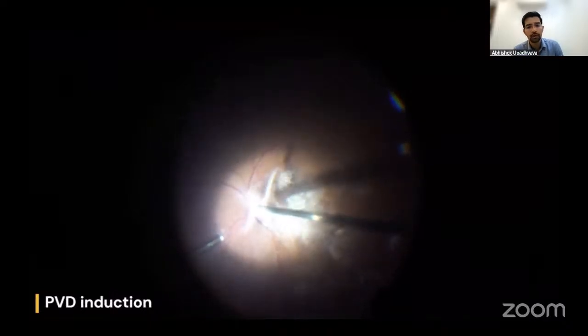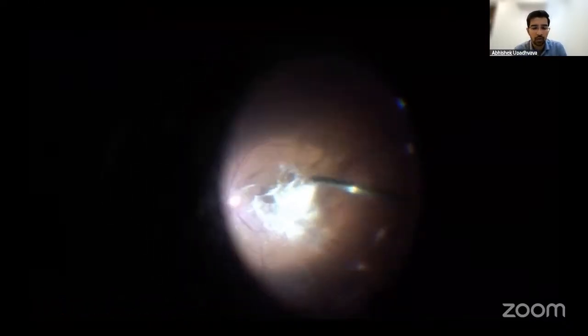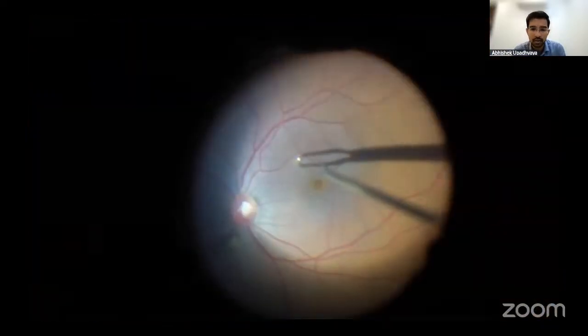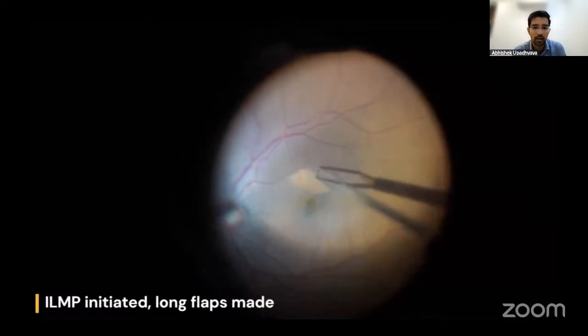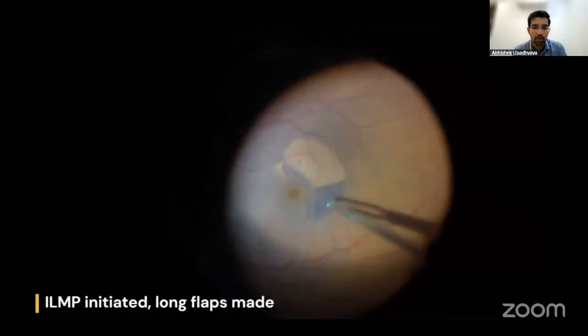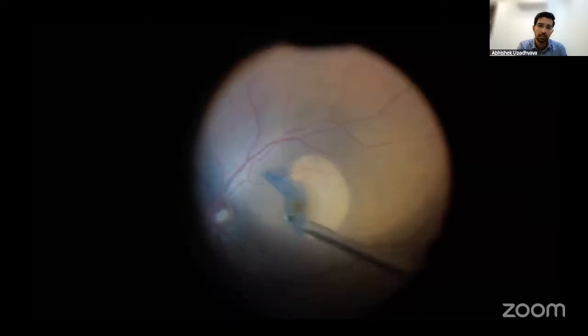This was a 45-year-old female patient with a macular hole, and there was no cataract, so I opted for just vitrectomy in this case. The conventional steps we have skipped. After BBG staining, since this was just more than 400 microns, I had planned initially for multiple flaps because that is the usual technique that I would opt for. I started from the inferonasal location since it was much more convenient for me to start the peel in that particular direction with my right hand.